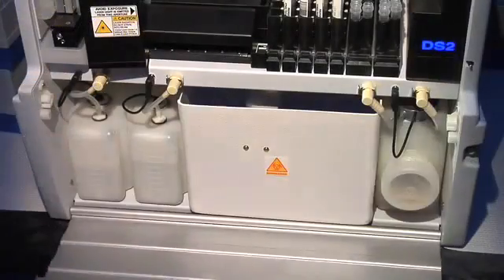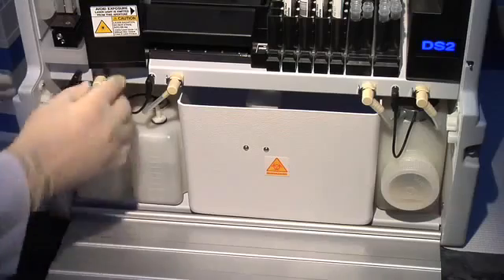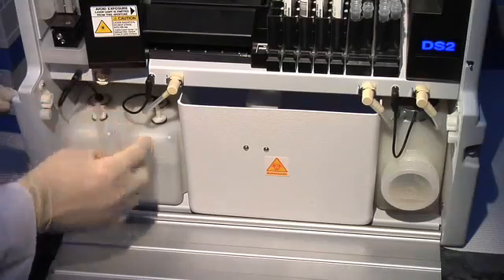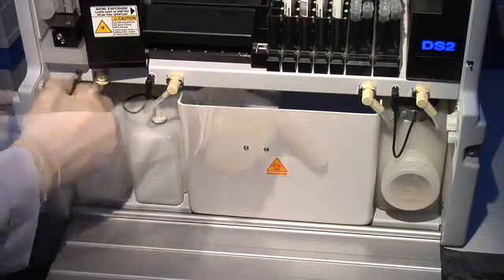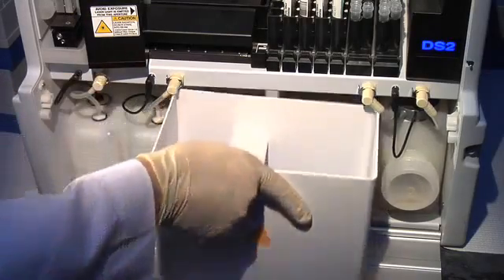A vertical orientation saves space while providing quick access for loading consumables or emptying waste.